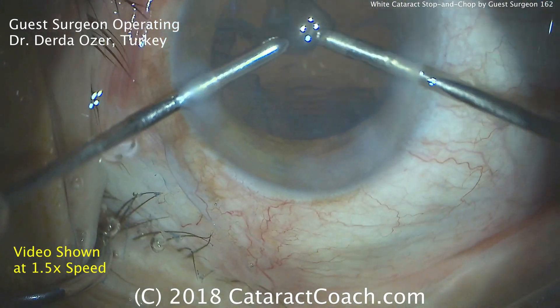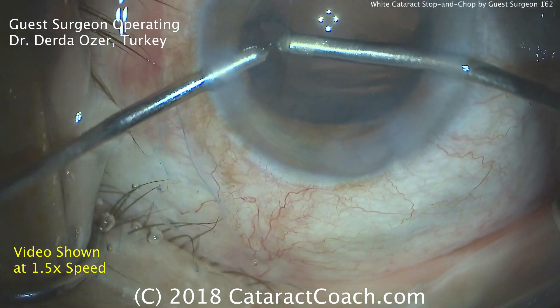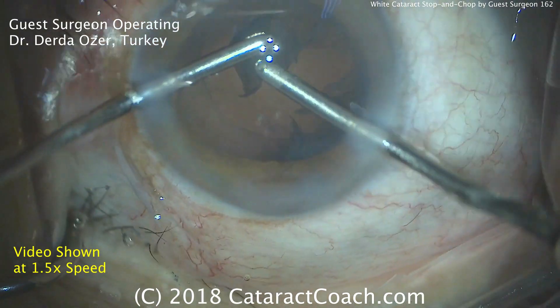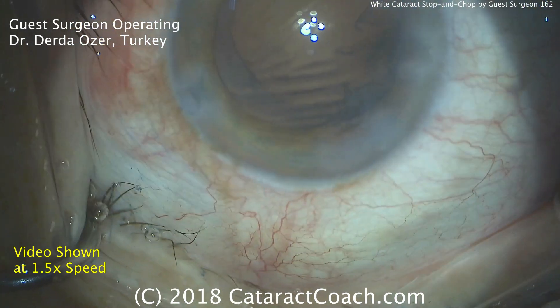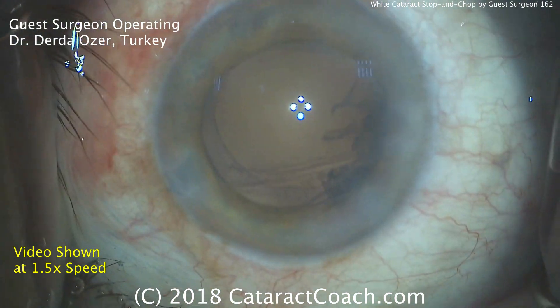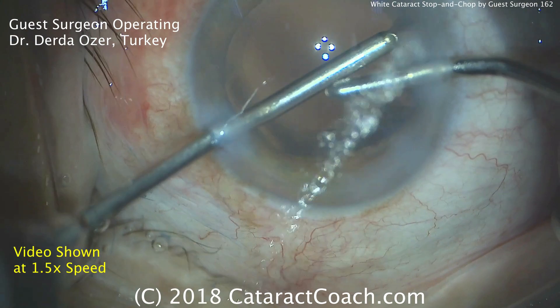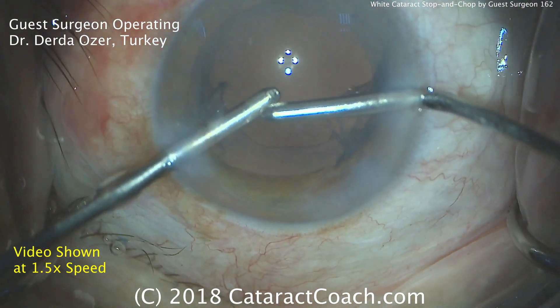We are showing the video at two times normal speed — you can certainly slow it down or rewatch it, but this is an efficient way. Most of the cortex has been removed. Now the hand switch comes: the right hand is the infusion and the left hand is the aspiration, going in to remove the remaining cortex. The rhexis looks great — beautifully centered, nice and round, appropriate sized.